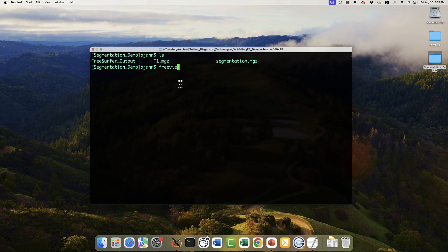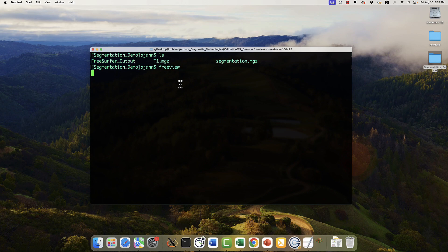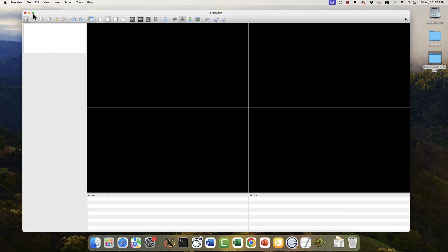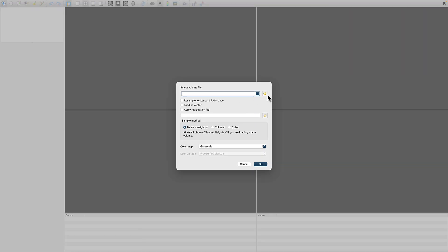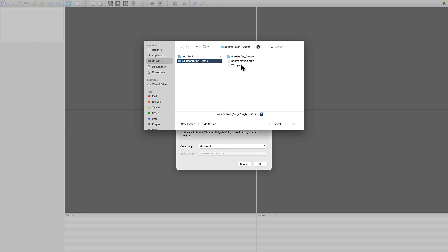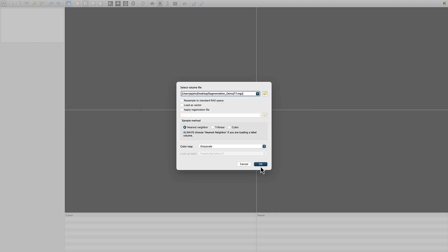If you have FreeSurfer installed, type freeview from the terminal, and you should see this window. I'm going to expand it to use the entire screen. Then click on File, Load Volume, and select the T1 weighted MGZ file. Click OK.